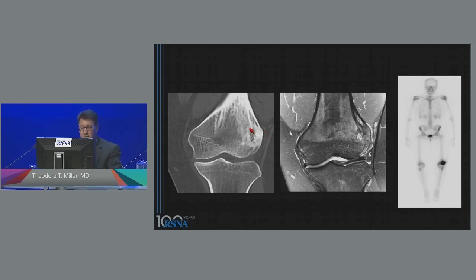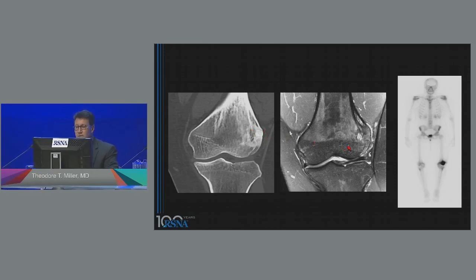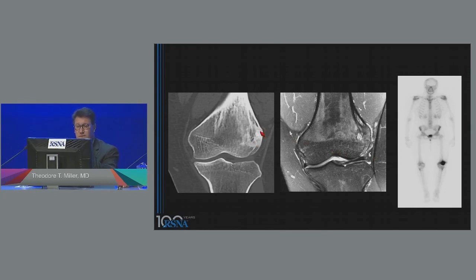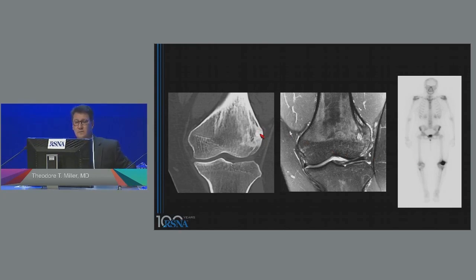Three images: a coronal reformatted CT, a coronal fat-suppressed T2-weighted image, and a whole-body bone scan. My eye kept getting drawn to this sclerotic focus. I'm thinking this is some sort of bone-forming process, maybe an osteoid osteoma or an osteoblastoma.